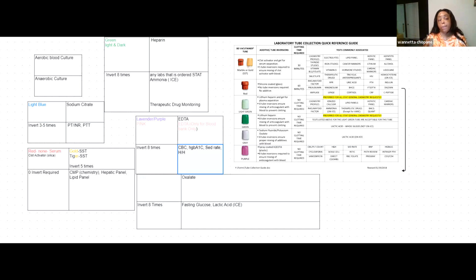So people who have a hemoglobin A1c test, either you're getting that done every year with your physical, or you are a diabetic and the doctor has you go to the lab every 3 months to check your A1c. Okay, if you hear A1c, people just say that for short, but the whole word is hemoglobin A1c. But what you see here is the abbreviation for it, just like on your sheet. It still says HbA1c. That's your most common test in your lavender or purple top tube. Next, it'll be your SED rate. Okay, that is a most common test in your purple or lavender top tube.